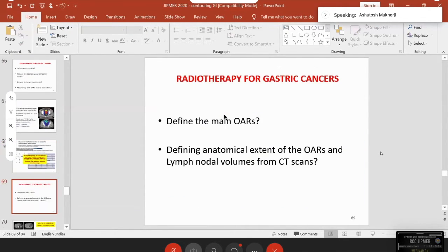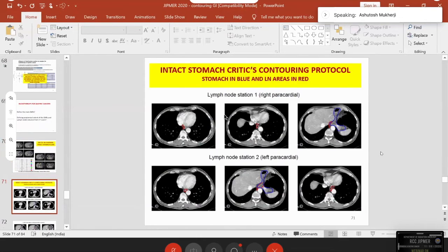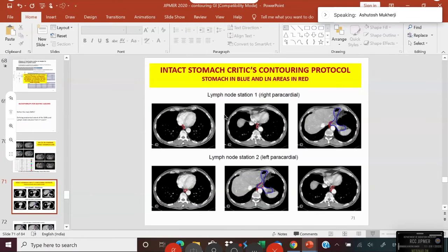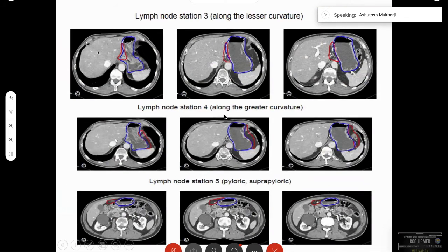The right and left gastric nodes along the gastrohepatic ligament come down and slope towards the left gastric artery. We have to include those areas — going down, it is better to take a sleeve of the liver rather than suffer the risk of recurrence.